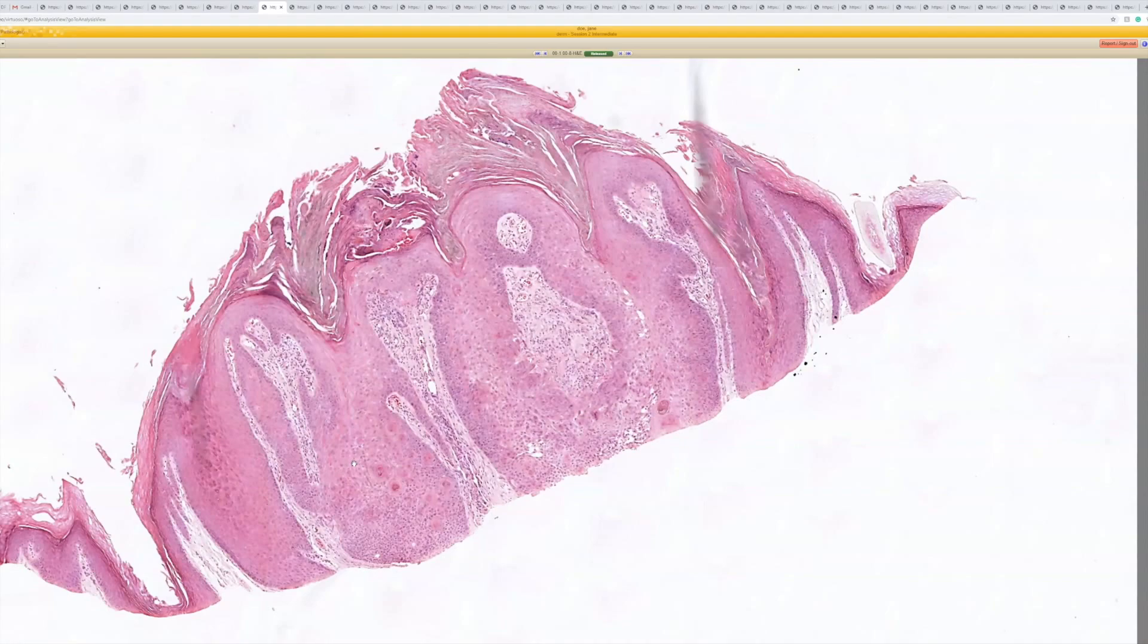One is trichilemmoma. Trichilemmomas have a warty surface like this, and when they get irritated, they can kind of give this a bit of a squamous eddy look, and they have some outer root sheath differentiation, obviously, which is analogous to what you can see in an IFK, which kind of is growing down into a follicle structure or recapitulating a follicular growth.